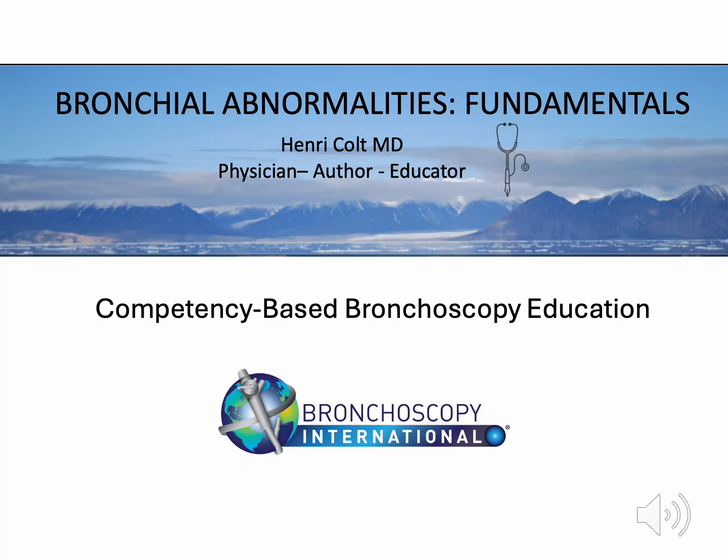My name is Henri Colt, and this presentation is part of Bronchoscopy Academy, an ongoing competency-based curriculum in flexible bronchoscopy. The goal of this work is to improve procedural understanding, anatomical recognition, and clinical judgment while helping reduce patient suffering associated with unequal expertise and inconsistent training.